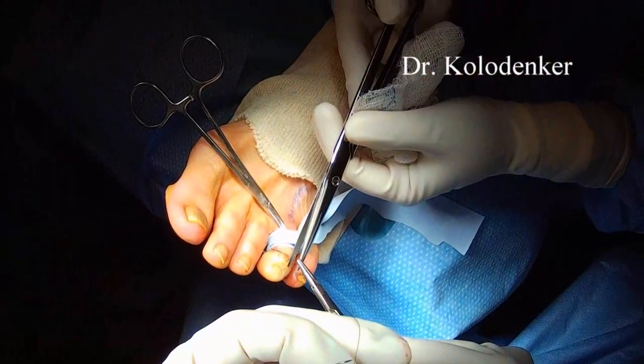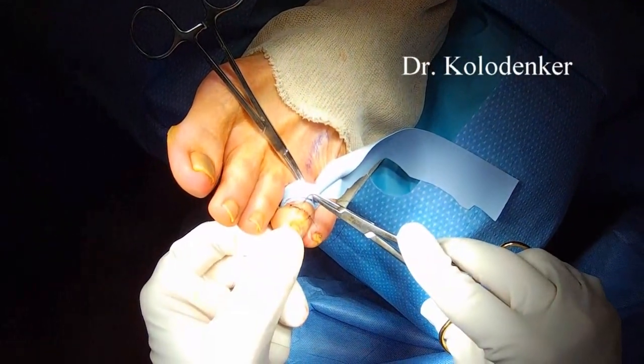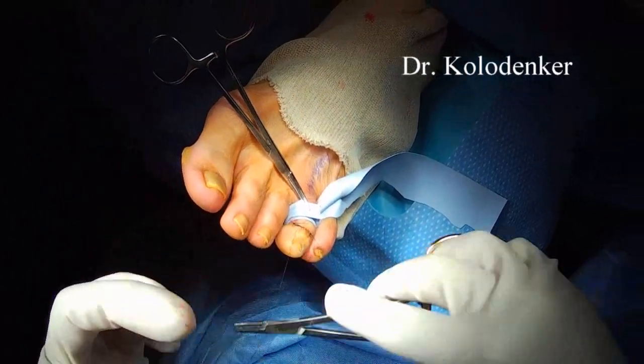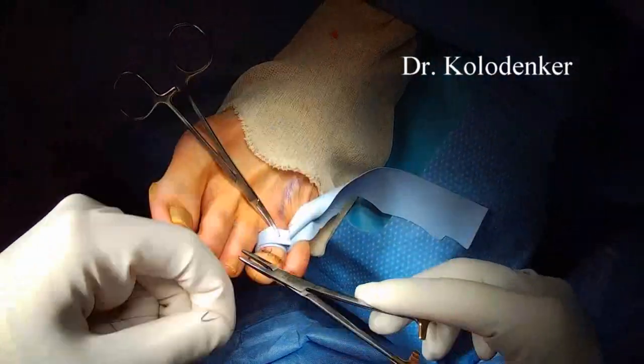Irrigate with copious amounts of fluid and then start suturing up. You can use a deep suture — typically I'll use monocryl — and then close the skin with nylon. Simple sutures are ideal, and they can be removed in about two weeks.